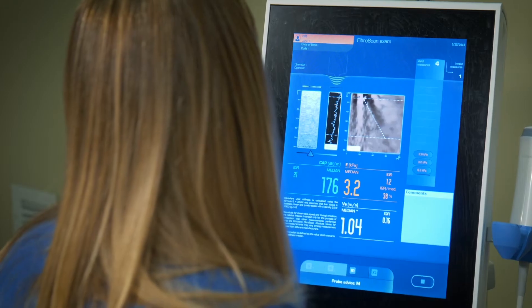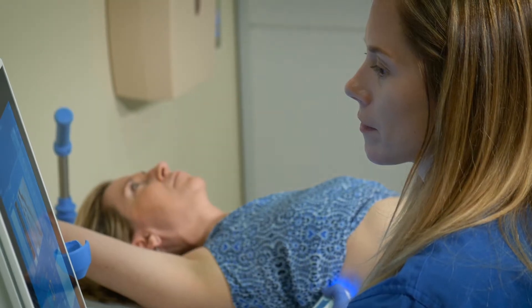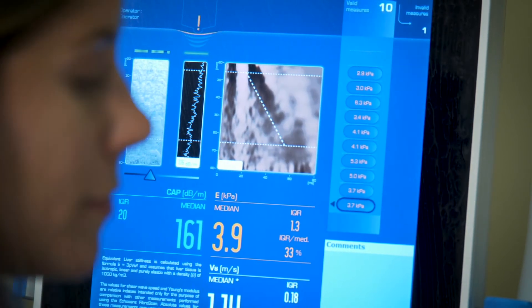Once we put the probe in the right position and press a button, it sends a vibration wave to the liver. The machine reads the vibration wave — the speed of the wave as well as the attenuation of the signal. We usually take ten measurements and the result is the average of ten. You get the results instantly.